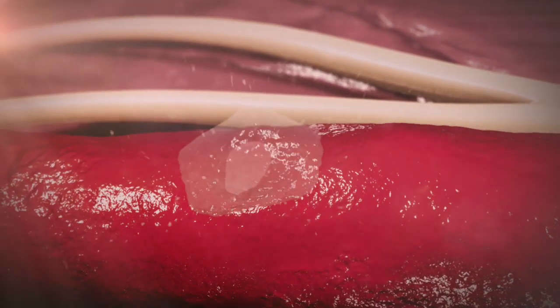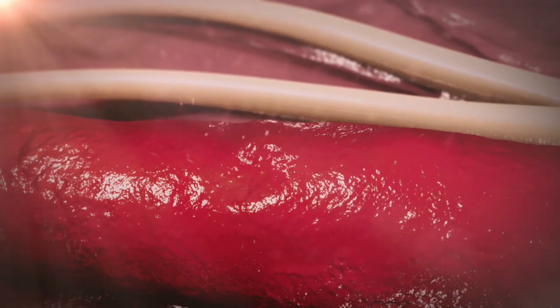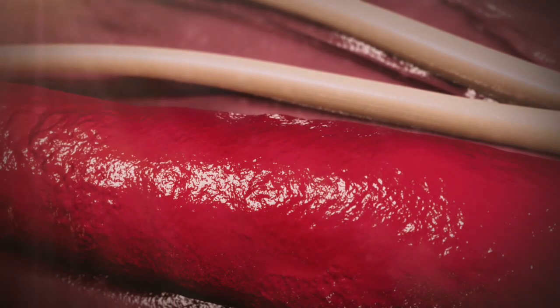Within 30 days, the sealant is completely reabsorbed, leaving nothing behind but a healed artery.